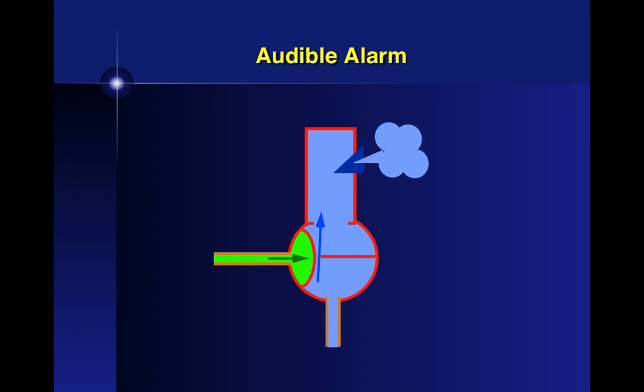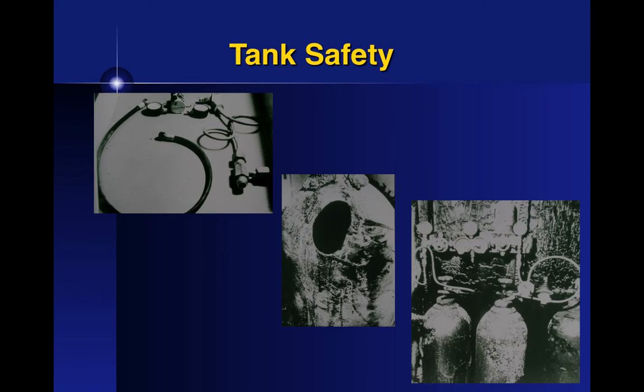And then there's this whistle. When the oxygen line is pressurized, the diaphragm closes this release vent off, and so you don't get the whistle. And there's no question in your mind when you run out of nitrous or oxygen, you have the similar whistles. They're quite shrill. They will gather your attention.